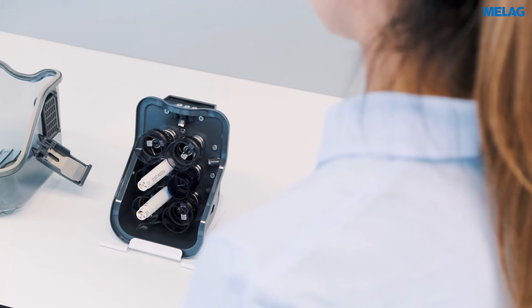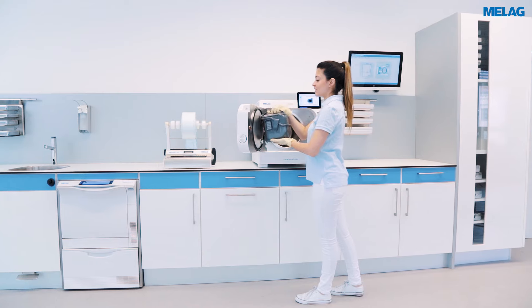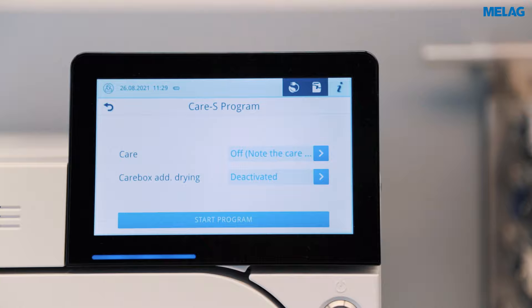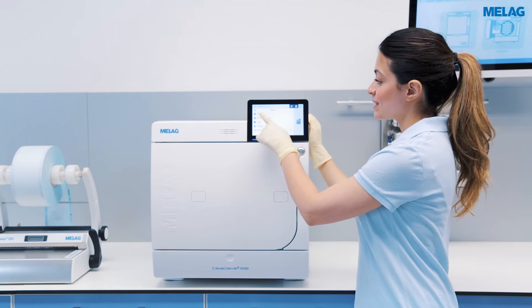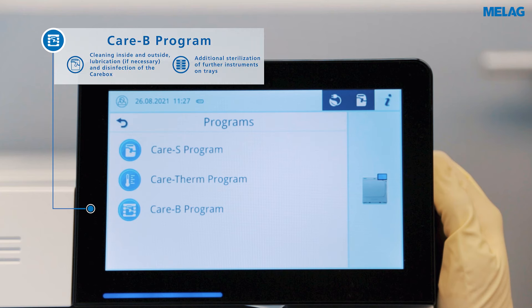When reprocessing scaler tips and prophylaxis hand pieces in Carebox Green, the care process is automatically deactivated. With the CareB combination program, you can even sterilize further instruments in the rear part of the chamber, in addition to the Carebox.